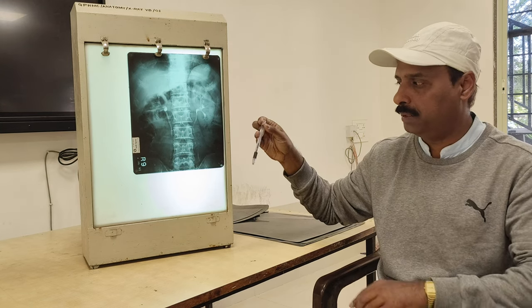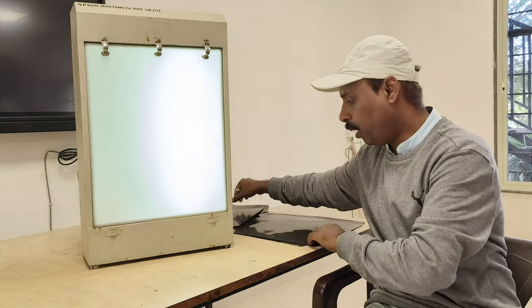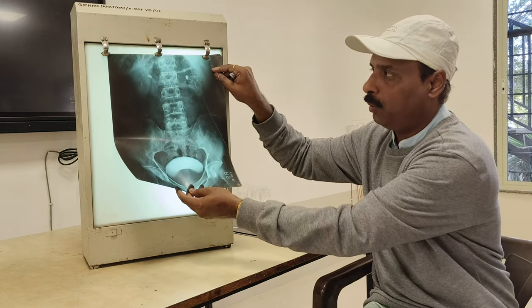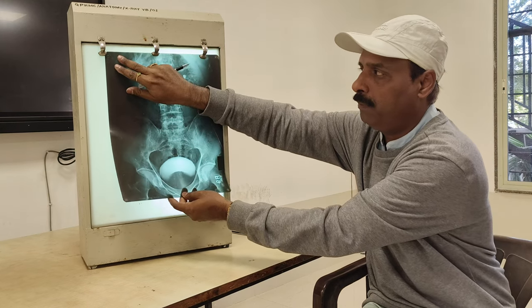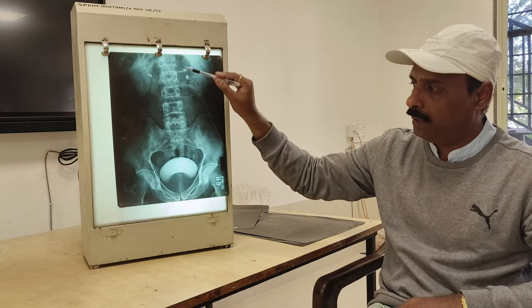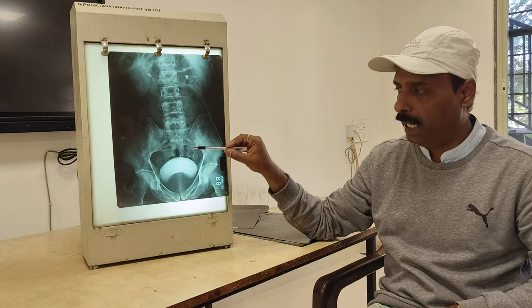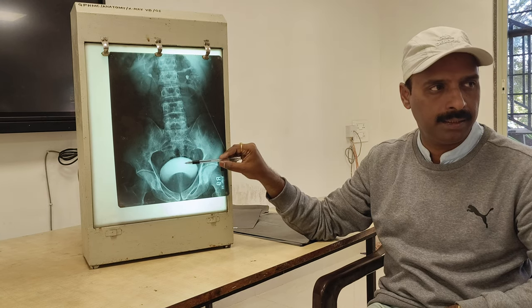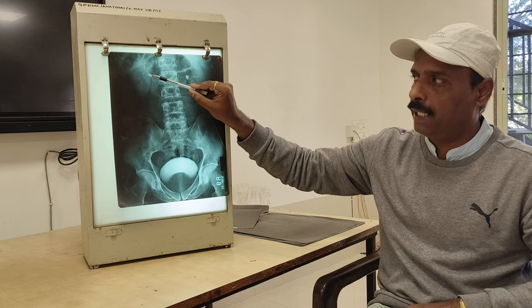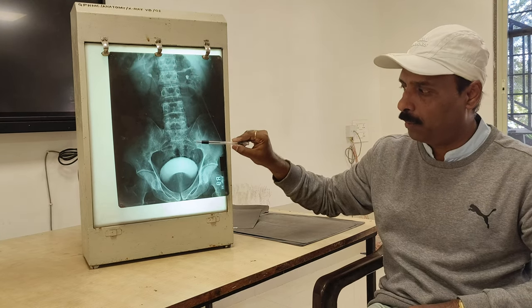This is also a special contrast variety of X-ray, that is a pyelography. This is also a pyelograph which you can remember. Here you can see the urinary bladder filled with the excreted dye. In this pyelography you can again see kidney stones, with the ureter normal.